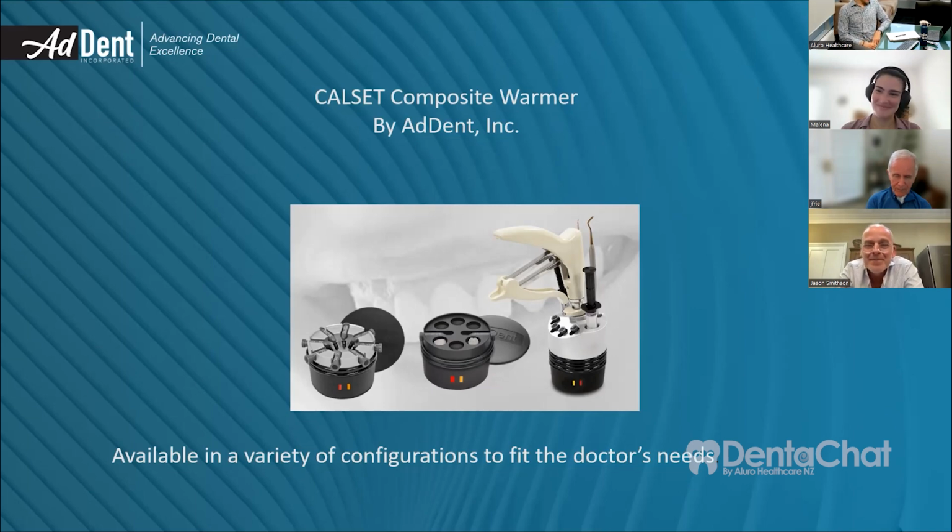Yeah, fair enough. That's good. Now, the other question I have is, I actually don't know if other brands of composite heater will go higher on temperature than what Calset does. I do understand that some composites have a limit of temperature you can go to. However, and I'm not generalizing all dentists, but some dentists in New Zealand tend not to read the instructions and want to go as hard as they can. Well, I'm guilty of that as well sometimes, so I can't criticize that. Not always, but sometimes.